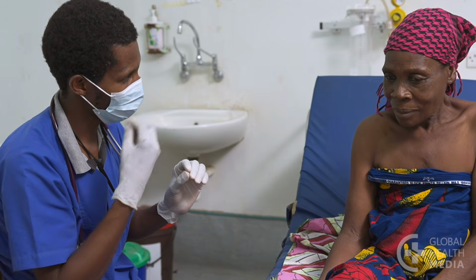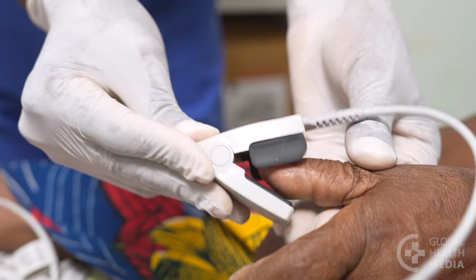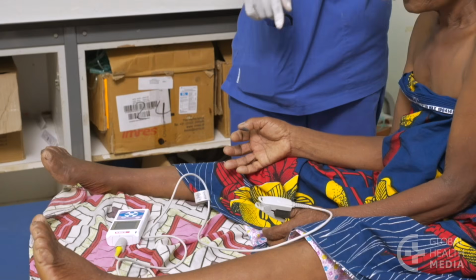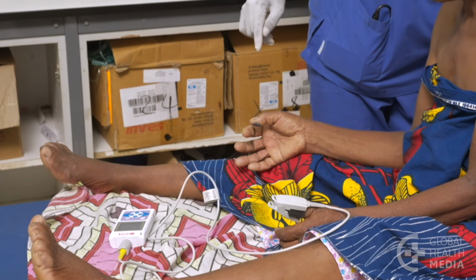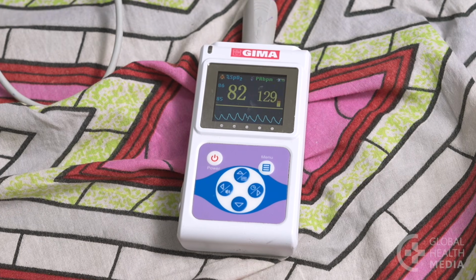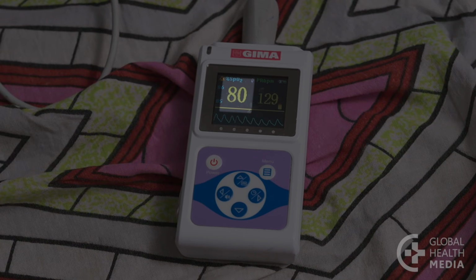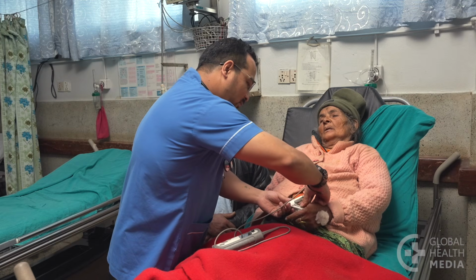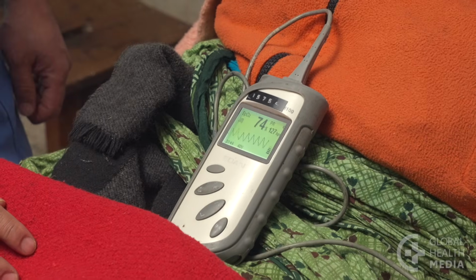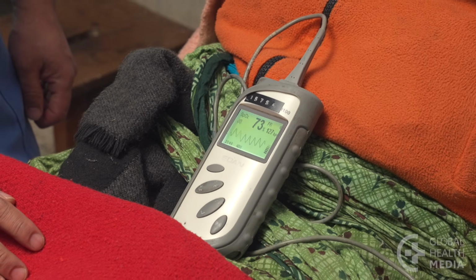Wear gloves and a face mask. If available, use a pulse oximeter to measure the level of oxygen in the patient's blood. A patient needs oxygen if their oxygen level is less than 92%. A patient with COPD needs oxygen if their level is less than 88%.